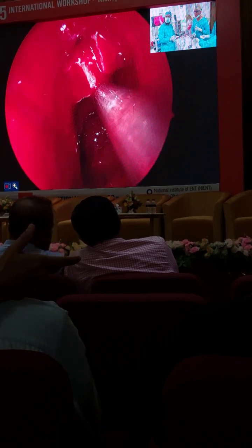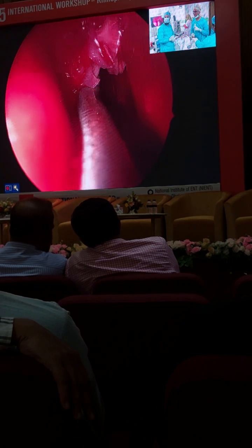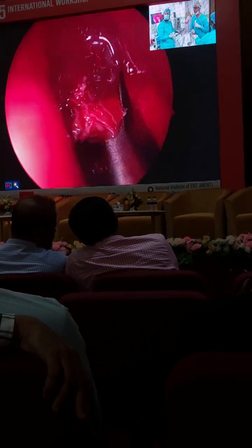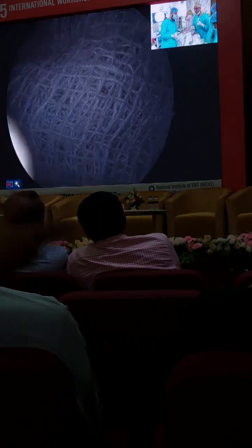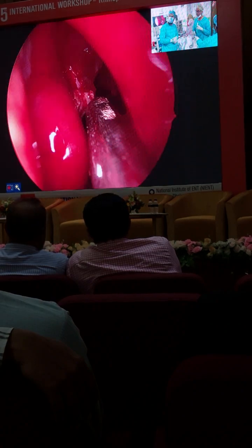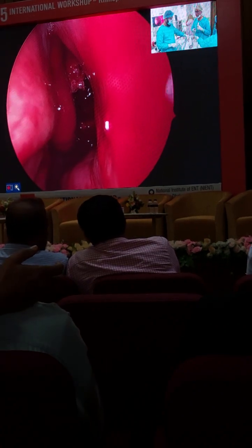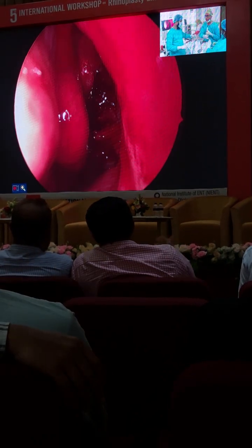Okay, so we're just fracturing bone. Beautiful. And you want to just get a leverage in fracture. I don't want to scrape the skull base, but then I'm going to take the mucosa out. Whether I take the mucosa out or not will depend on whether it is polypoidal. In most situations, even with polyps like this, we try and save the mucosa upward.